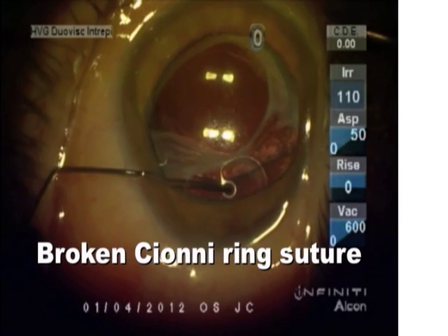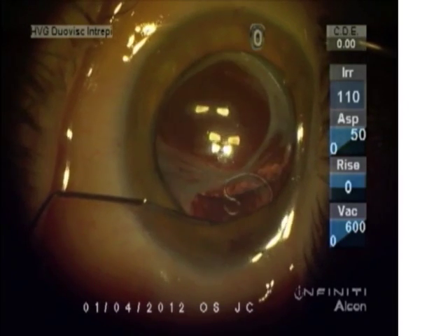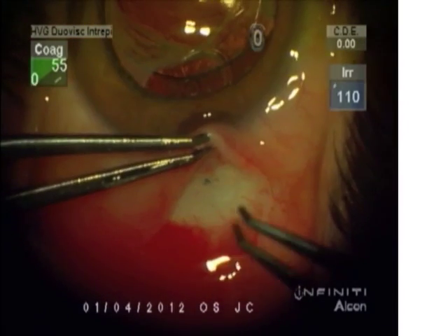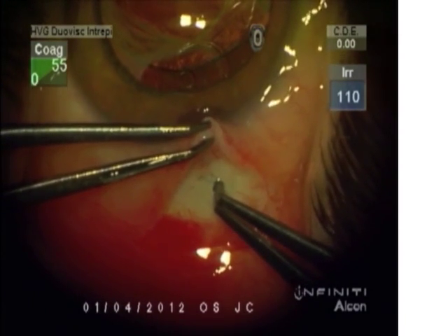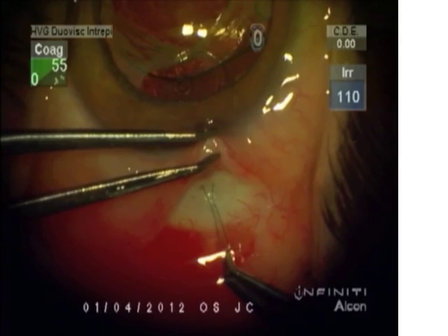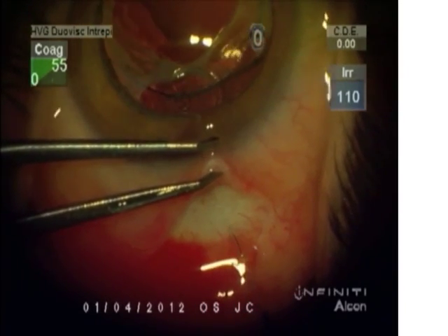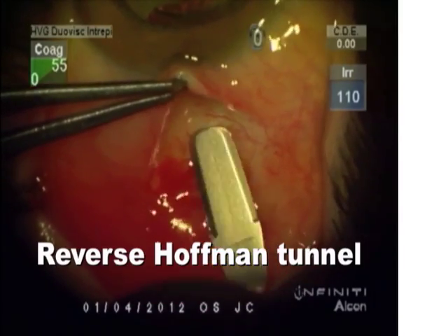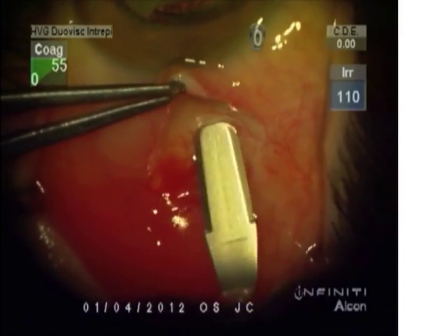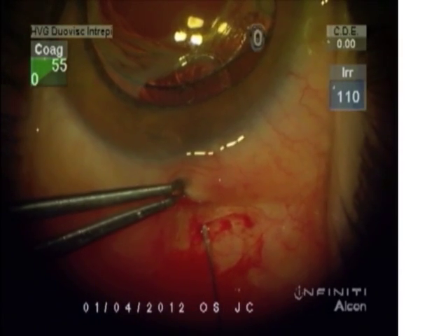You can see this broken Sione ring has allowed this bag IOL complex to subluxate. We're sitting in a temporal position here. You can see as I pull this 10-O proline suture out, it's broken at the tip. This is a reverse Hoffman tunnel for placement of a 9-O proline suture.